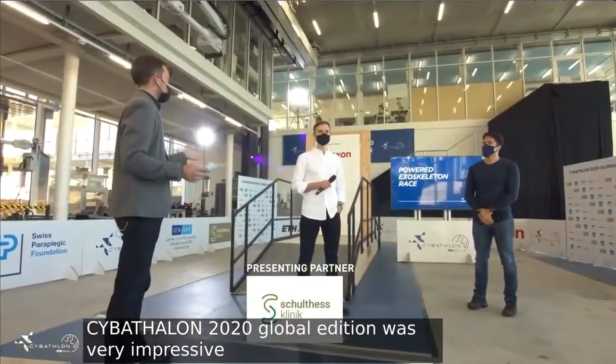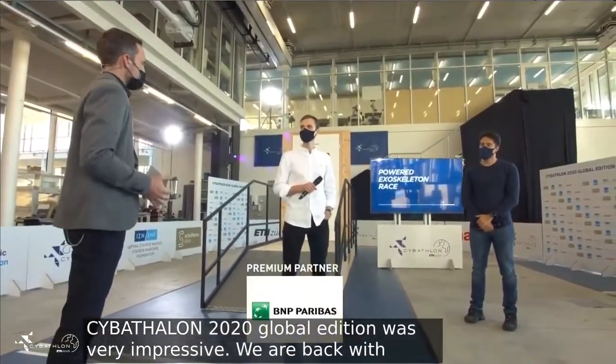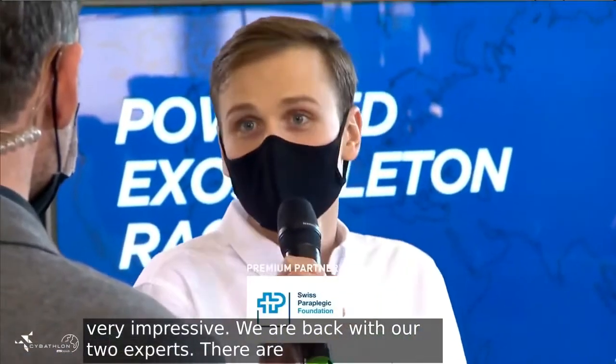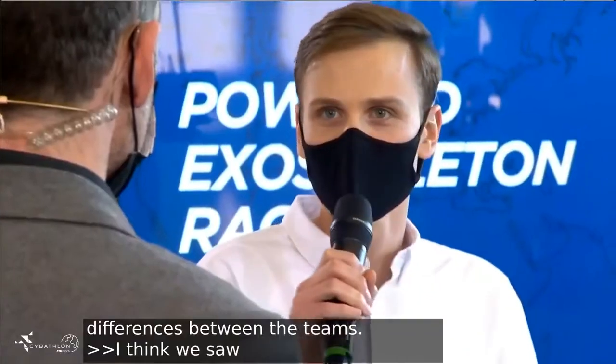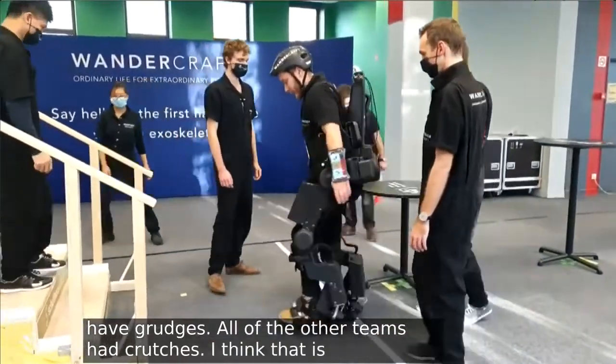Our two experts — it's really impressive. But there are also big differences between the teams. One team didn't have crutches, whereas all the other teams had crutches. And I think this is very important to point out, because it is very, very hard to have such a device working without crutches.